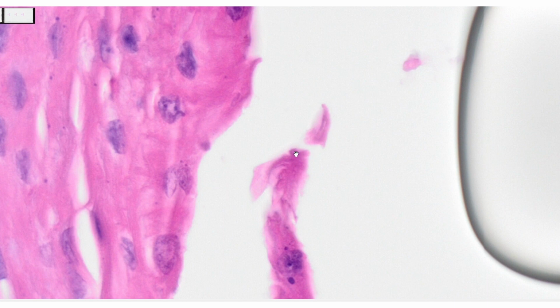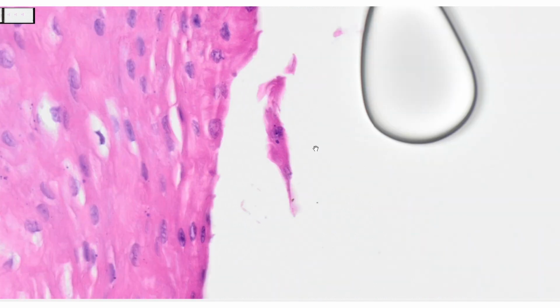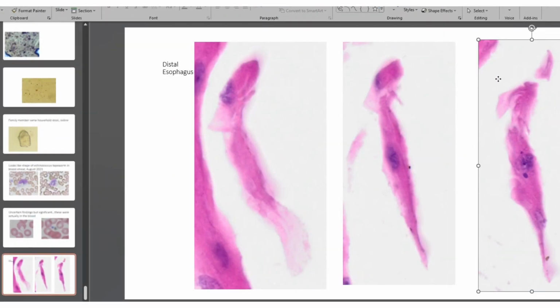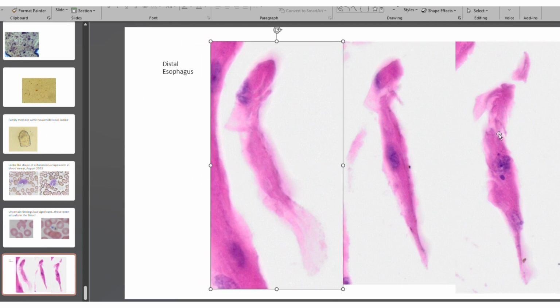So here's the other hook broken off from this piece, and here's another hook. Now I went and looked at the other cuts, the best that I have here. So it's really hard to tell still, is this a separate worm here? I really can't tell very well. Maybe somebody else can identify it.